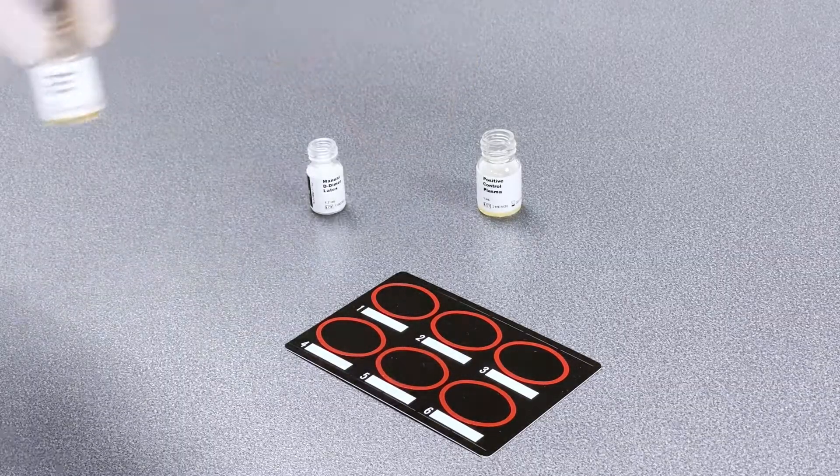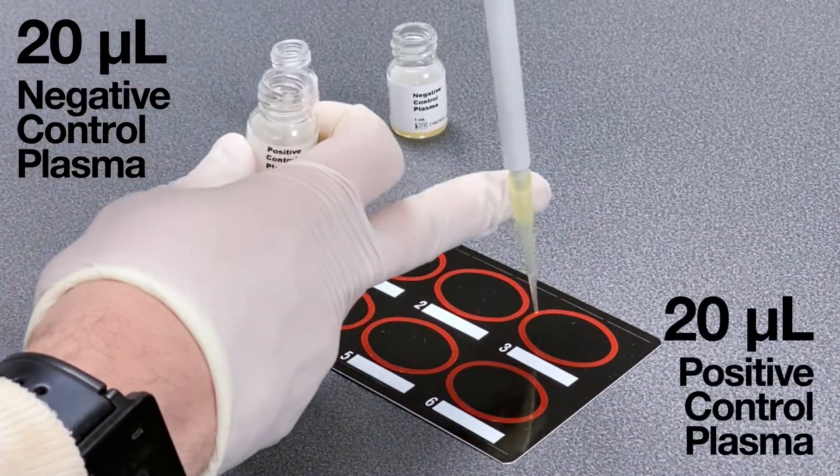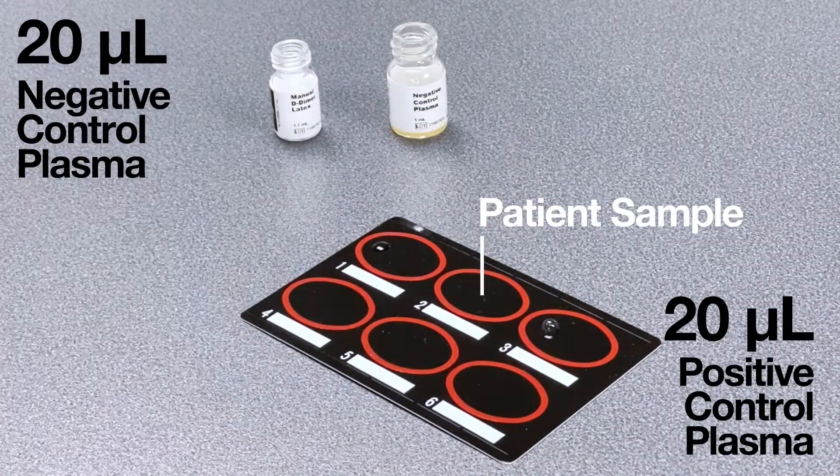Pipette 20 microliters of negative and positive control into the marked areas on a test card. Use the middle area for your patient sample.